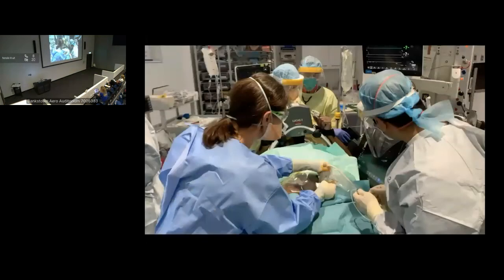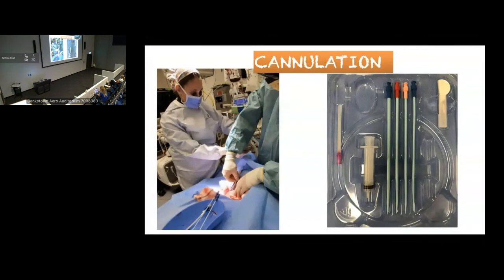All right, so basically what we do is we access the vessel. Hang on a sec, sorry. Now I've got the wheel of death. We access the vessel with an ultrasound. You must always use an ultrasound when you're accessing the vessel.